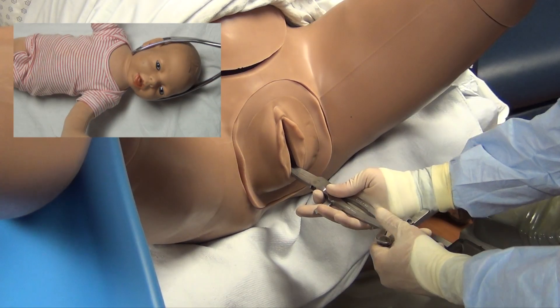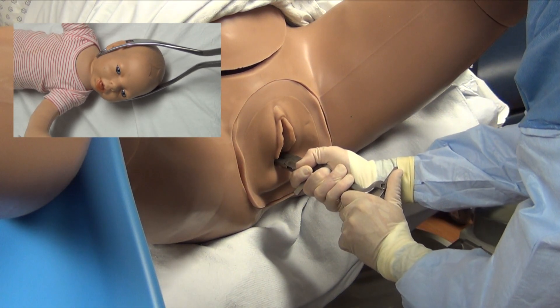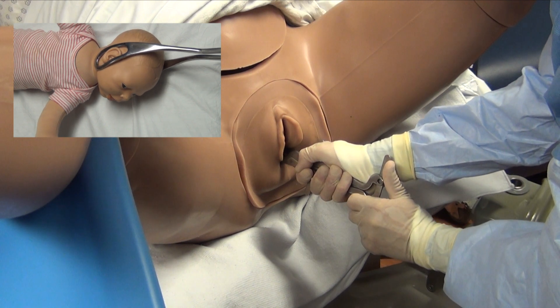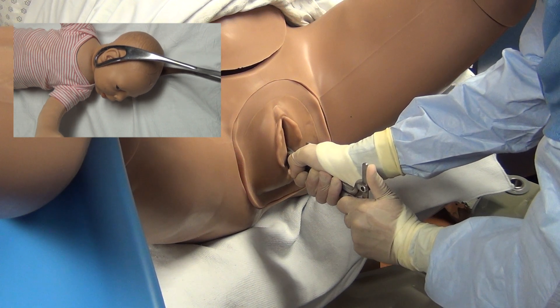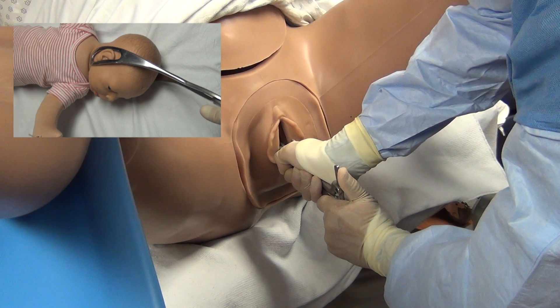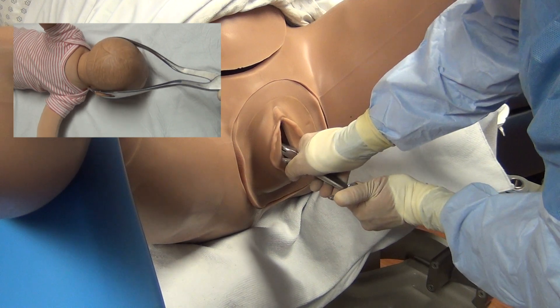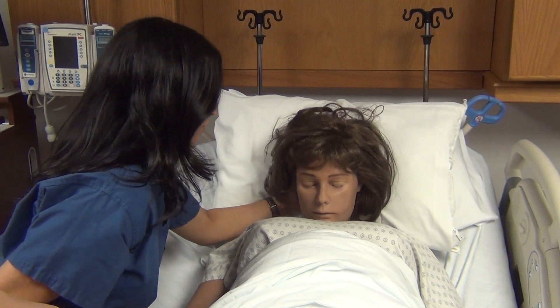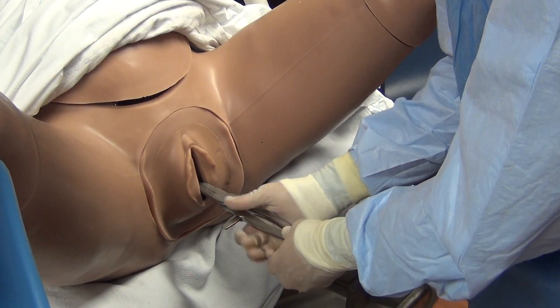The forceps are then closed and the fetal head station is reduced by gently pushing superiorly. The forceps handles are held secure by both hands of the examiner and are rotated in the proper direction — counterclockwise for left-lying fetuses and clockwise for right-lying fetuses. Again, at the transverse position, slight articulation of the forceps while maintaining some rotational torque allows the fetal head to flex towards the chest. This allows completion of the rotation, and often the examiner will feel a clunk or hear a small amount of suction released as the head rotates to the OA position. The forceps are kept in place while the patient pushes over the next two contractions to bring the fetal head back into the pelvic outlet and to secure the occiput under the pubic bone. Once in place, the forceps are removed.